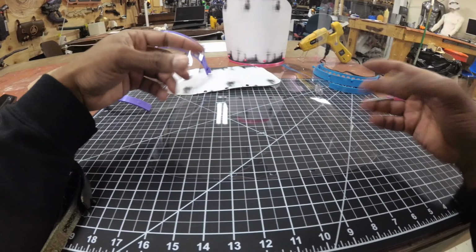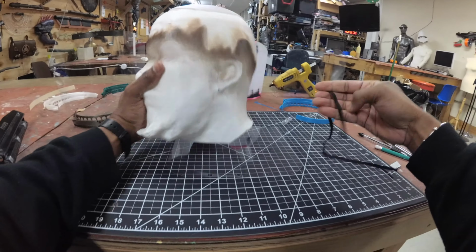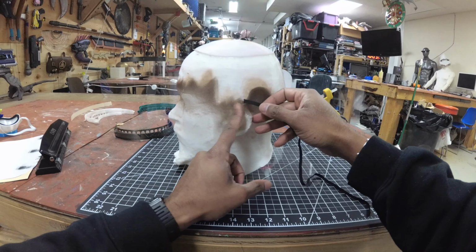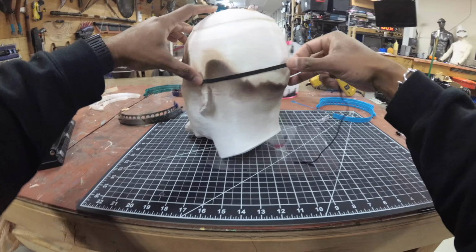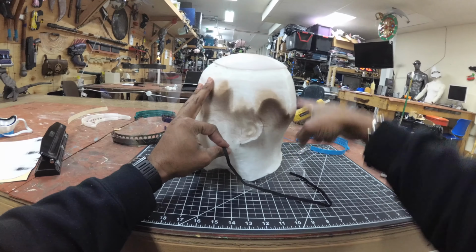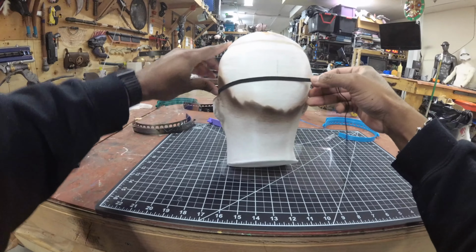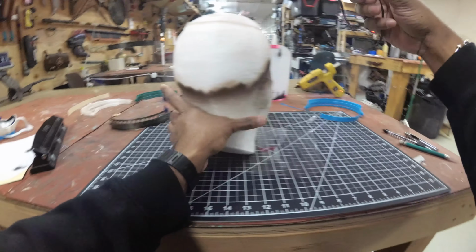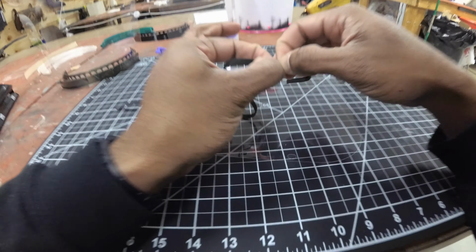So now let's just go on to how to strap it. Strapping wise, everyone's head and measurements are going to be different. So a little technique that I found is that if you measure from the top of your ear, the frontmost part of the top of your ear, kind of around the back of the crown of your head. So see how the head usually curves up here. So you want to go from the top of that ear over the widest part of the back of your head back to the other top of the ear. Okay. Grab that measurement, then you can cut that out.